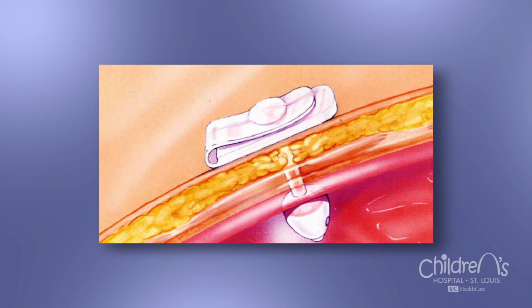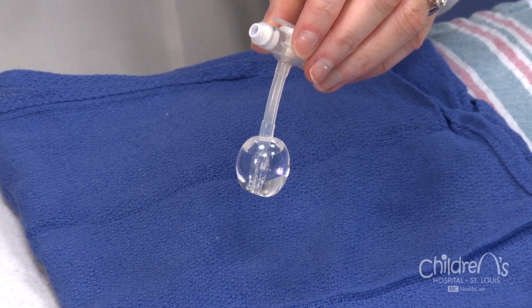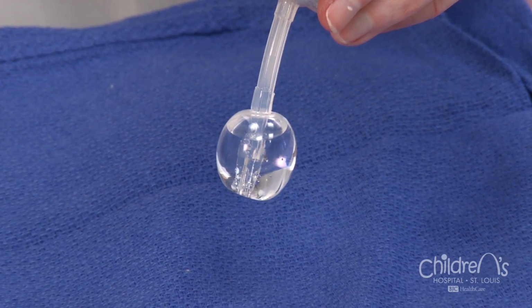The gastrostomy appliance is inserted into the stomach after it passes through an opening made in the skin, fat, and muscle layers of your child's abdomen. This opening in the skin is called a gastrostomy tract. The bottom of the gastrostomy appliance has a balloon or mushroom type of device that helps keep the appliance snug against the stomach wall without falling out.